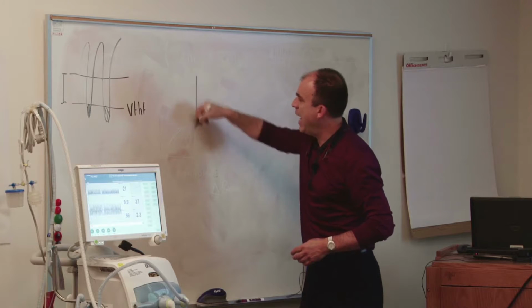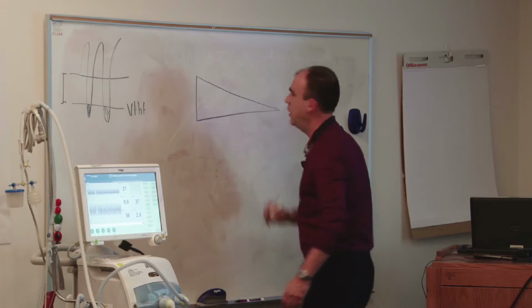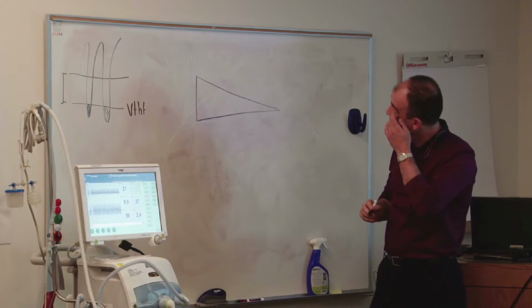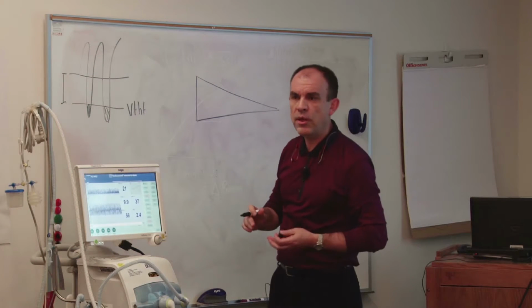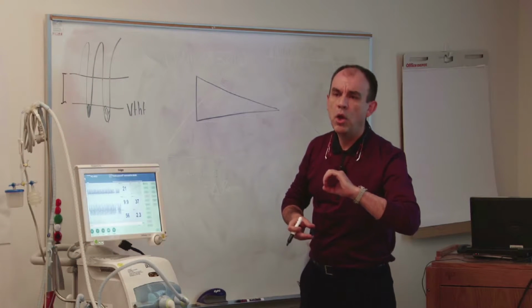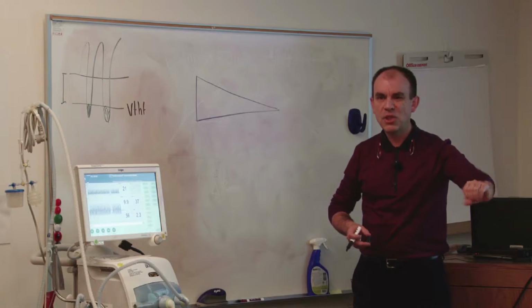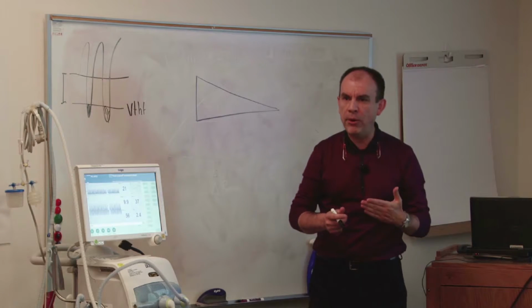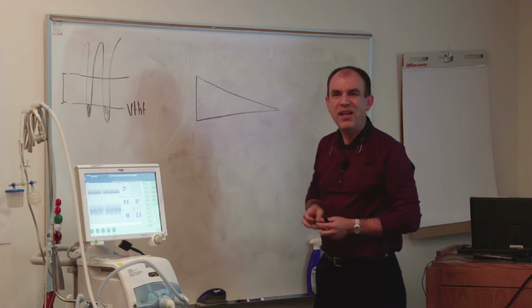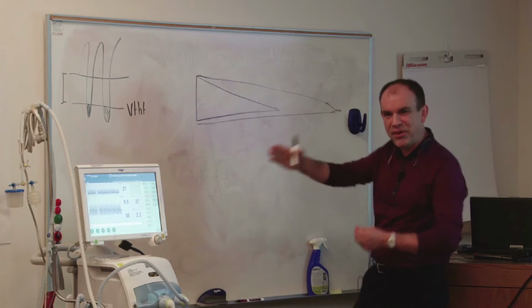So we begin with this amplitude here, but we have an attenuation as we arrive to the alveoli. Normally, the SensorMedics is not only efficient because of its huge diaphragm, but because of its very low compliance circuit, and it's quite straight. So it loses almost no power from the diaphragm, so this attenuation curve is like this. So it really is very long.